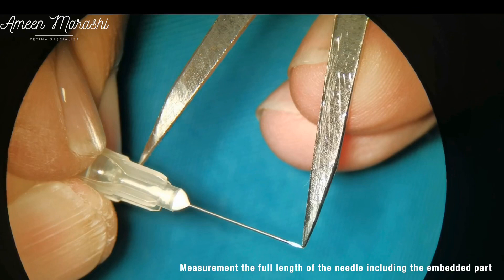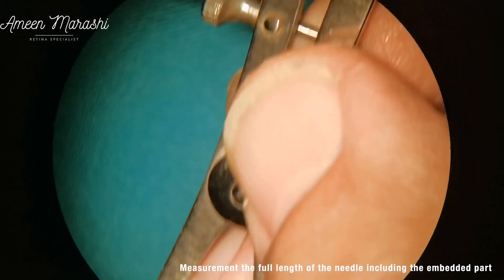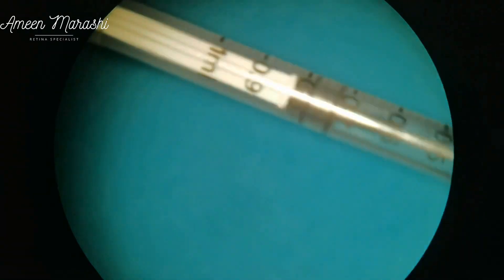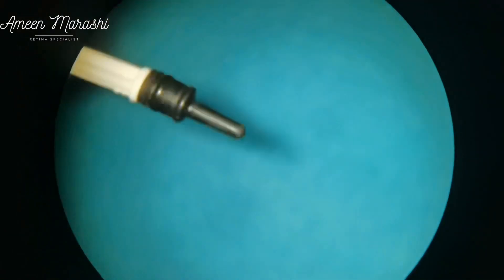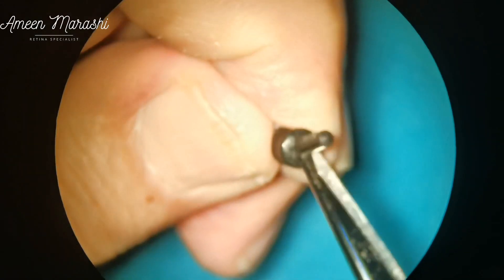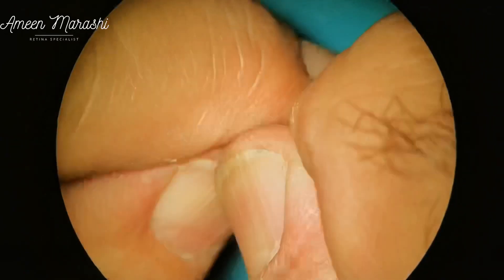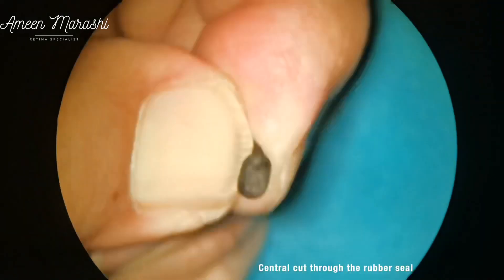Manufacturing starts by measuring the full length of the needle, including the part embedded in the needle plastic. Here the measurement is 19.5 mm. Please remember that needles do not all have the same length. The next step is to prepare the rubber part of the stopper by using scissors to remove the rubber seal's ramification. The rubber seal is removed from the plunger.